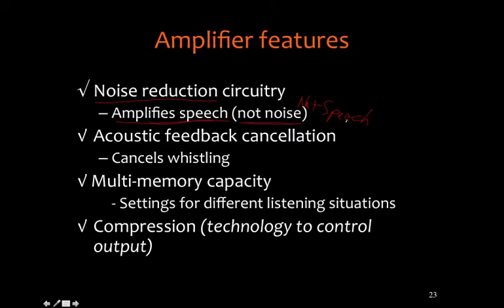Now, that's a key distinction, because if the background noise itself is speech, the hearing aid doesn't know what speech to amplify and what speech not to amplify. And that's the critical problem that faces hearing aid amplification to this day, which is how can you amplify speech but not amplify speech when it's in the background as noise.